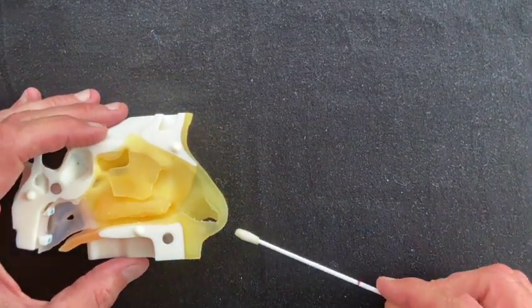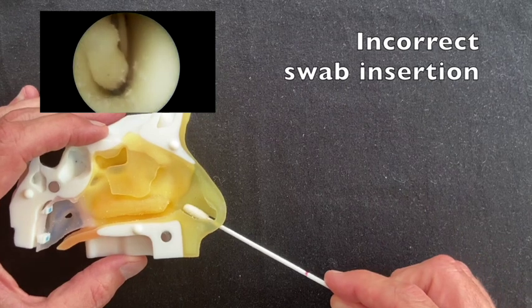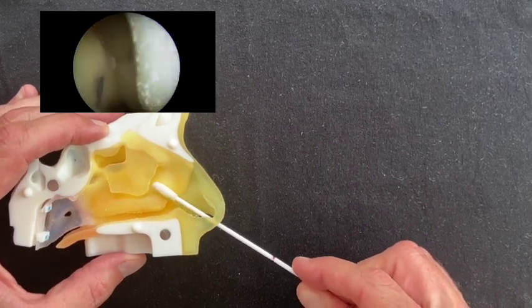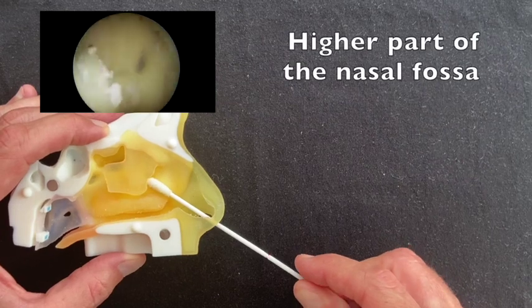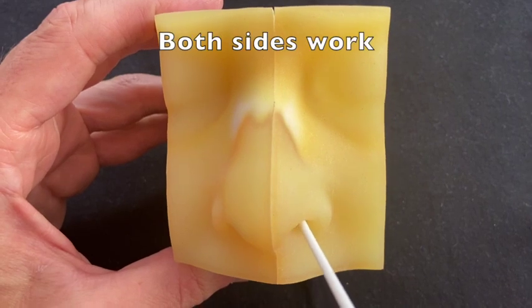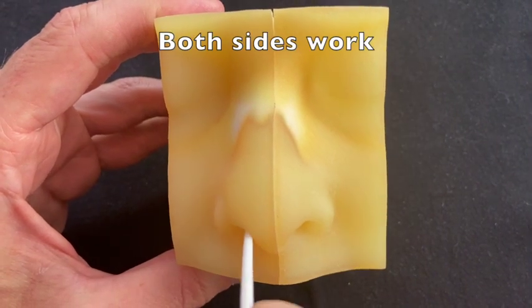The simulator also permits incorrect swab insertion, typically towards the higher part of the nasal fossa, which is of obvious benefit from a training perspective. Note that the simulator allows the procedure to be performed from both sides.